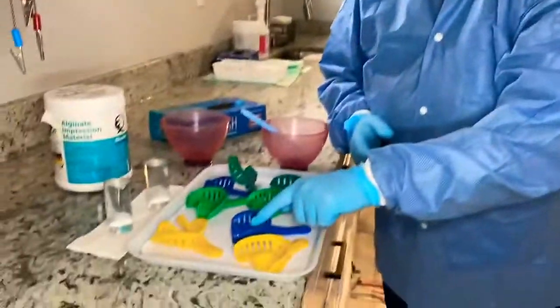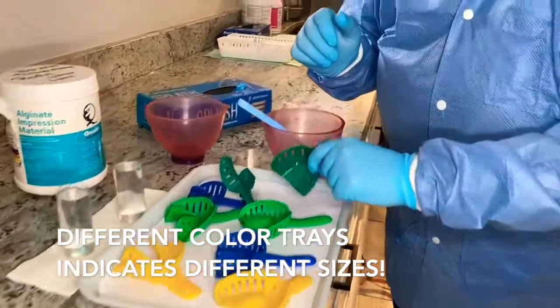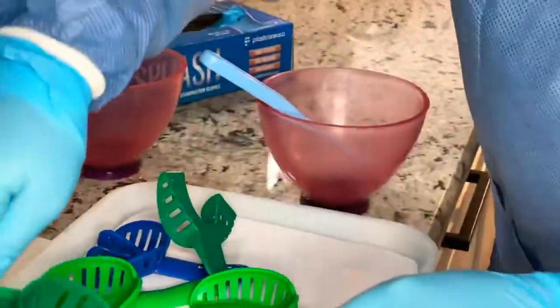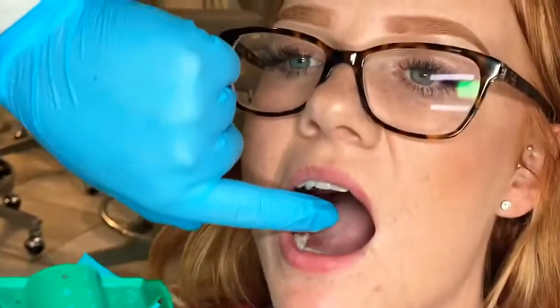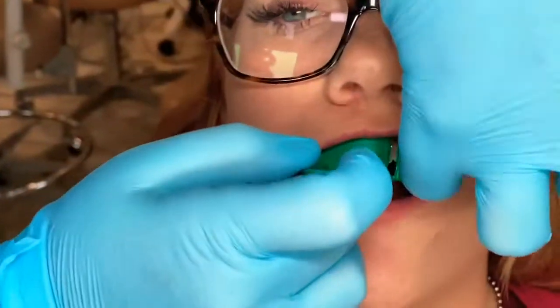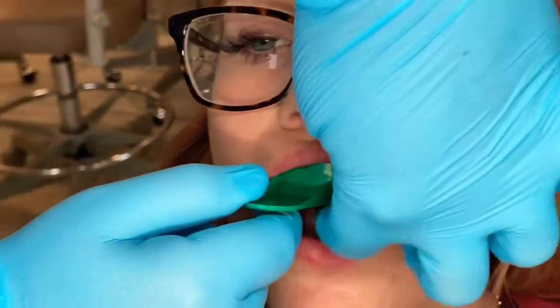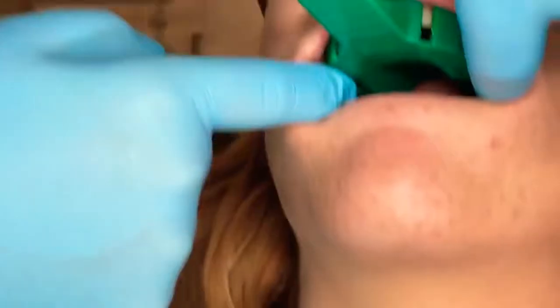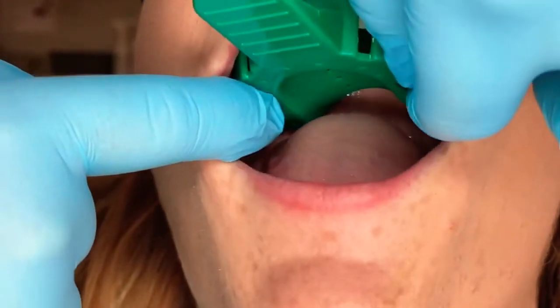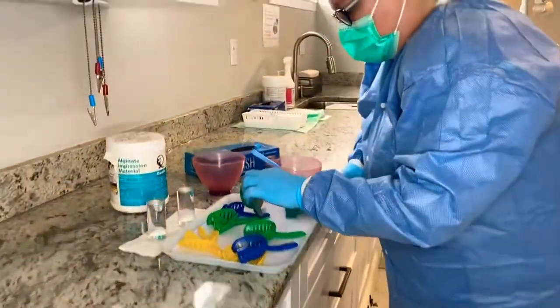That tray didn't fit — it was too small and it hit her tori on her maxillary. So I'm going to try a different tray that's just a little bit wider. We're going to see if we can place it in for comfort. Retracting her cheek, going in and up — making sure I don't hurt her. I want to make sure we're not having anything hold us up and everything's covered, including the back of the molar. This one's good.